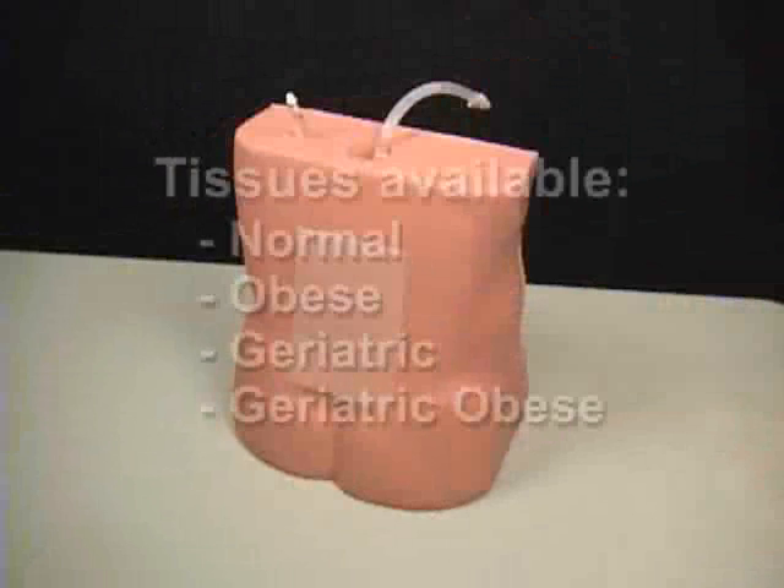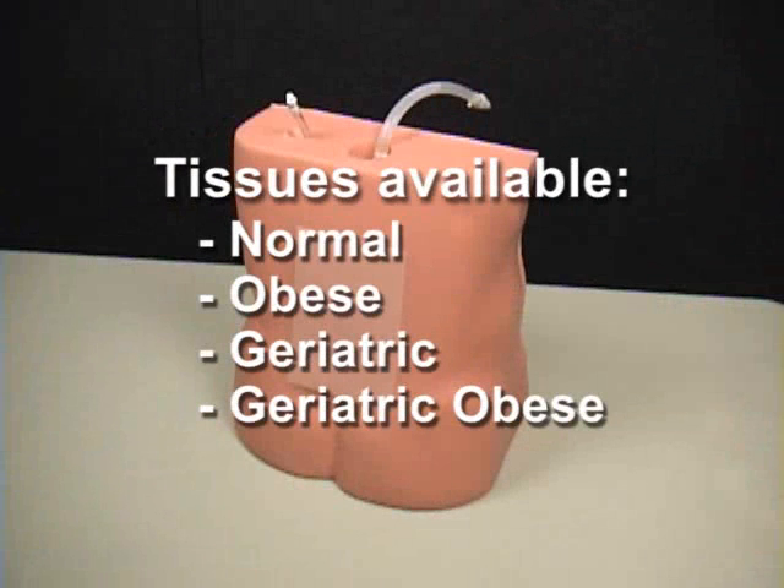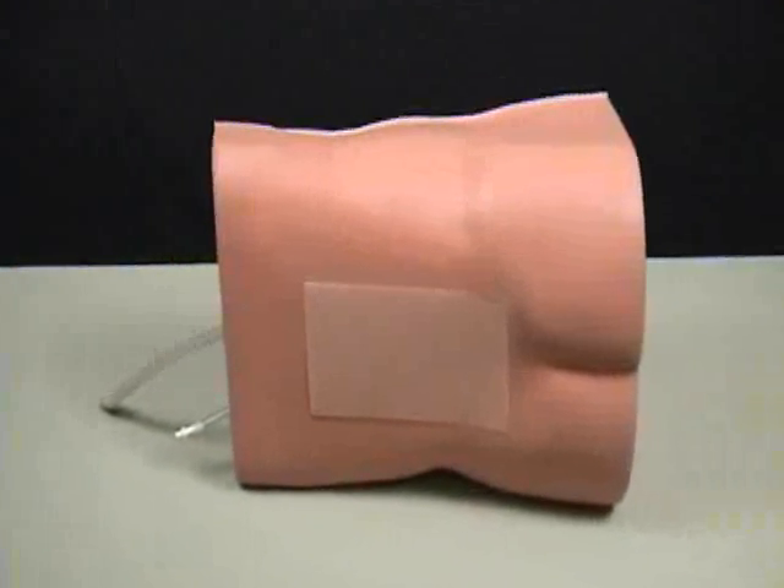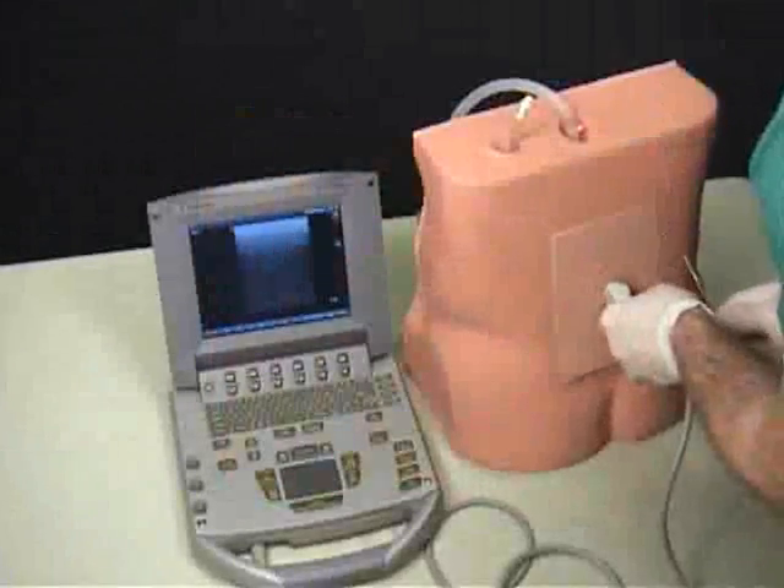There are four different replaceable tissues available for this trainer: normal, obese, geriatric, and geriatric obese. This versatile trainer can be positioned on its side or in an upright sitting position.